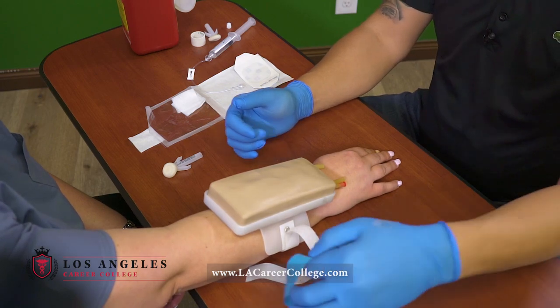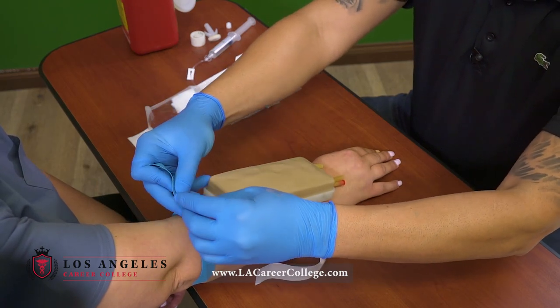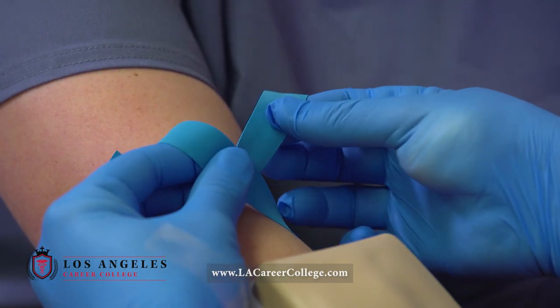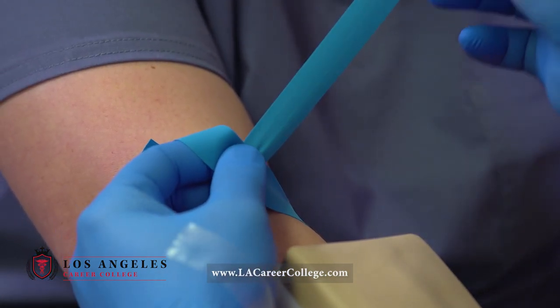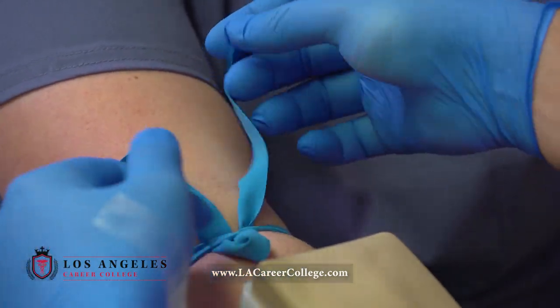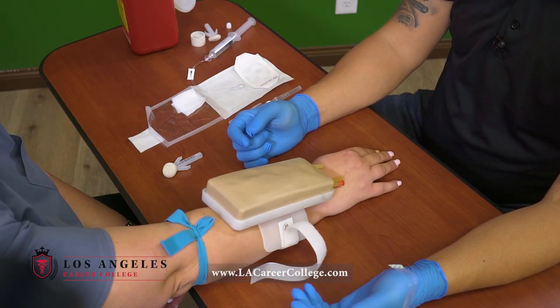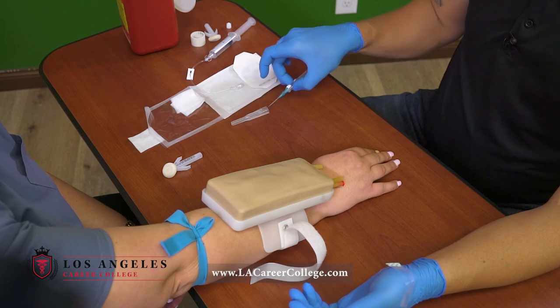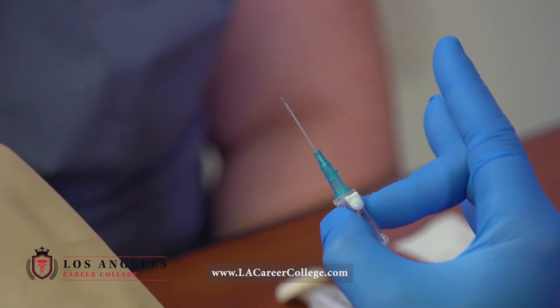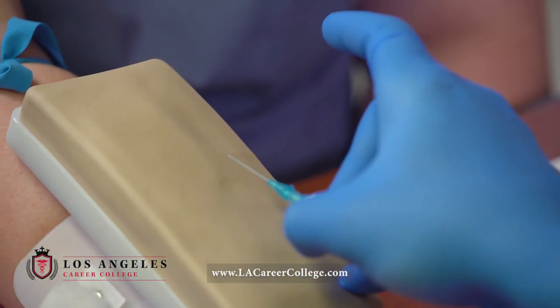Now that it's dry, I'm going to tie my tourniquet at least five fingers away from my IV site, and it needs to be a quick release. I will pull on one side, pull on the other side. Flaps away from the IV side again. Now I'm ready to start my IV. The correct way of holding a needle is in this way — these two fingers will stabilize your needle.